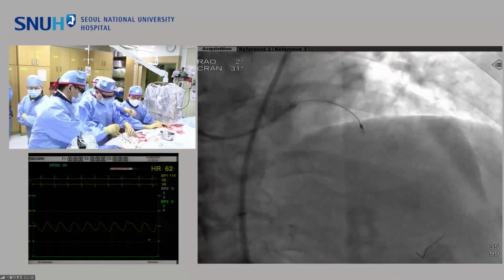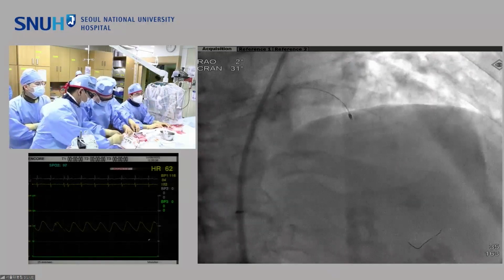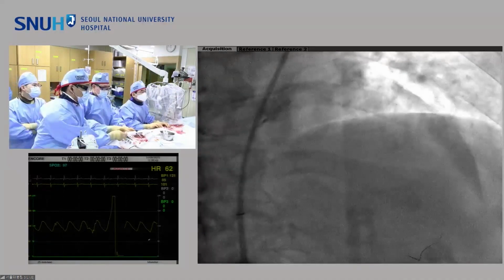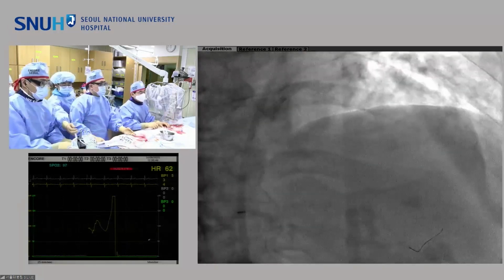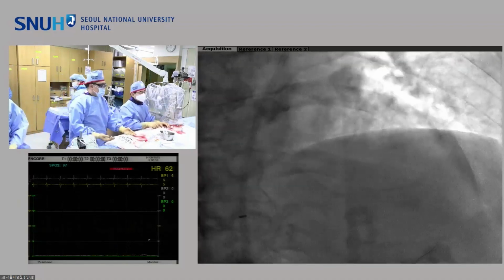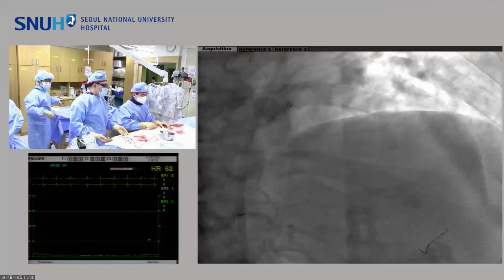Any comment from the panel? Does anybody have experience with this low speed technique? Anybody here? Nobody, probably. It is a very clever way to use the number of bar. So you are using the slow speed with 1.5, then you can achieve 1.75?